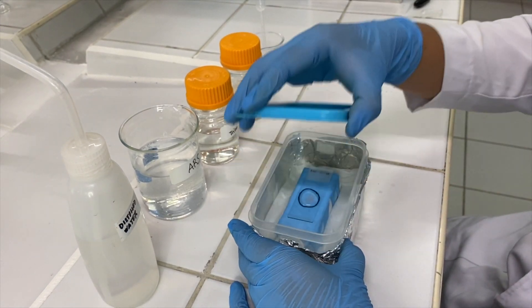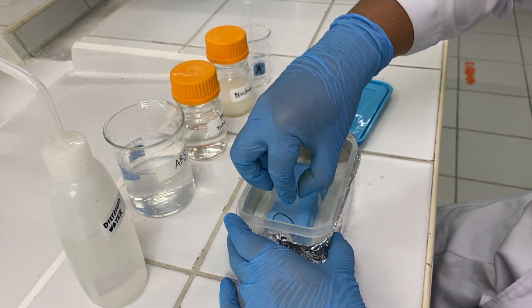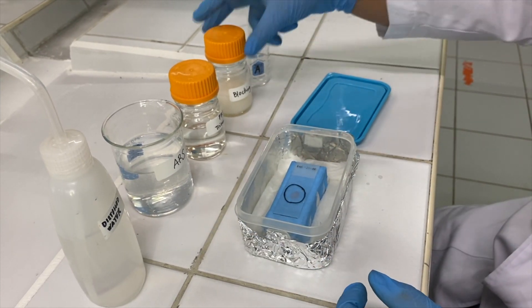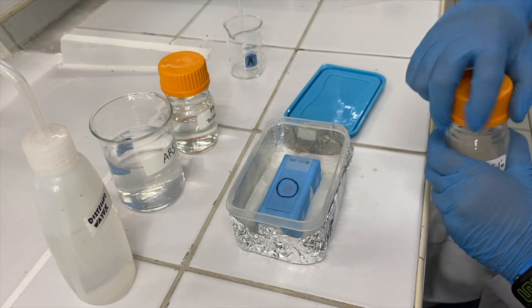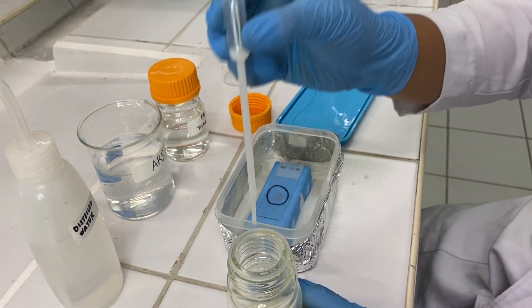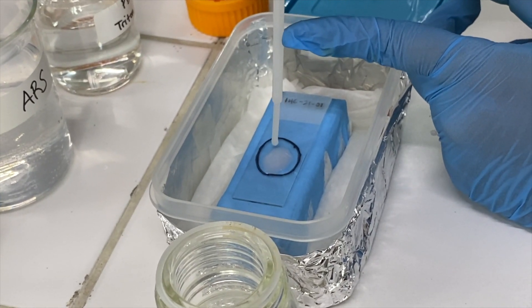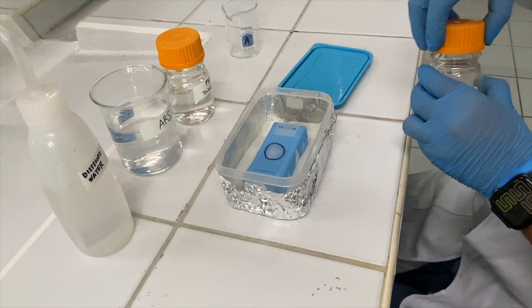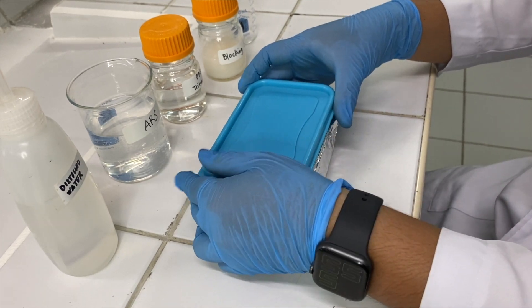Then remove the PBS and apply the blocking solution. Always ensure that the entire tissue is covered. Incubate the tissue with the blocking solution inside the chamber for 30 minutes at room temperature.